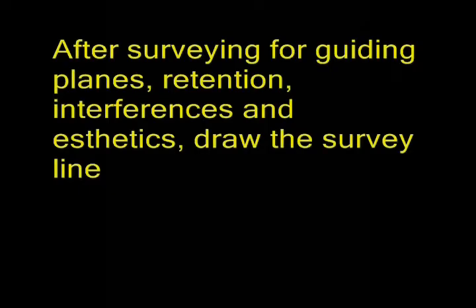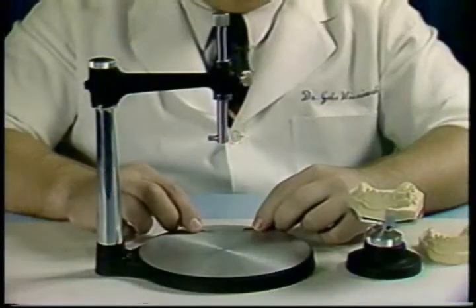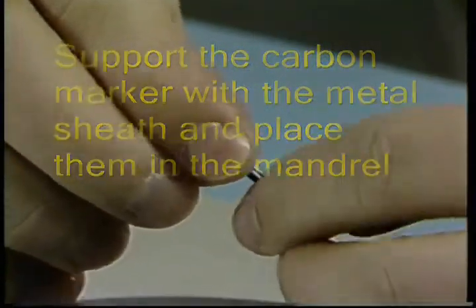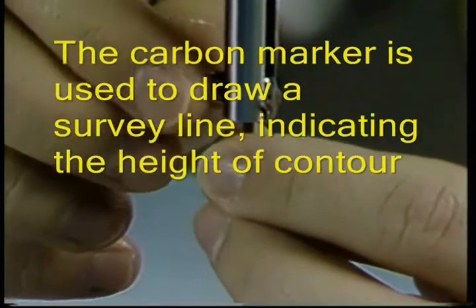After surveying for guiding planes, retention, interferences, and aesthetics, you will draw the survey line on the tooth, marking the height of contour. Support the carbon marker with the metal sheath and place them in the mandrel. Secure them to the vertical spindle.